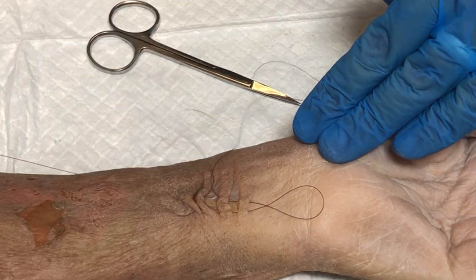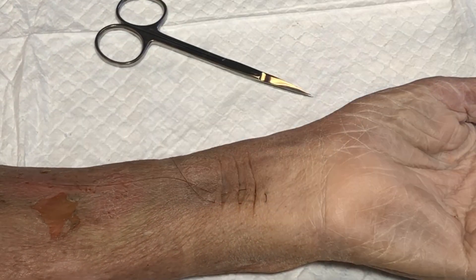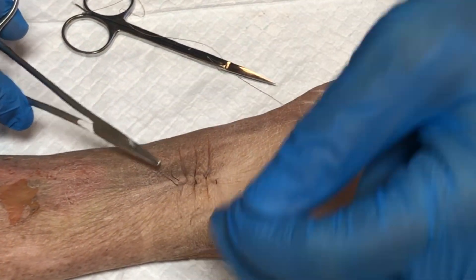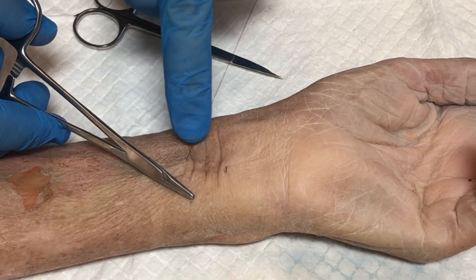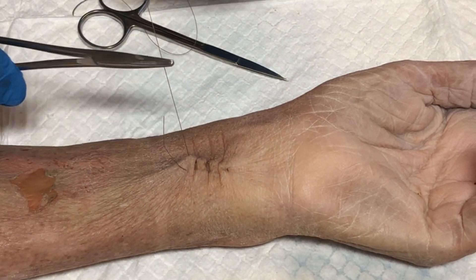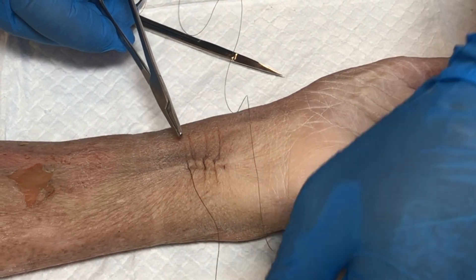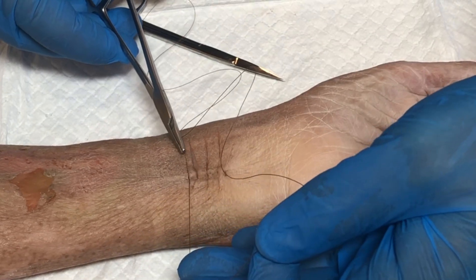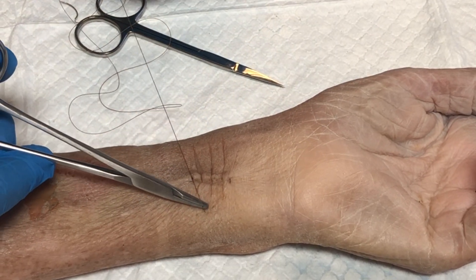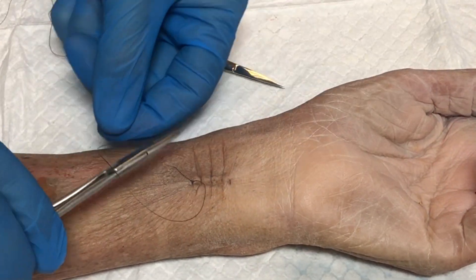Pull this all the way through, and then when you start to tie your knot, a little bit of tension shows how all this comes together. Do a standard surgeon's knot — pull across and see how this all comes back together. Doing your instrument tie, tying your knot, pulling in the opposite direction each time so that it lays down nice and square.